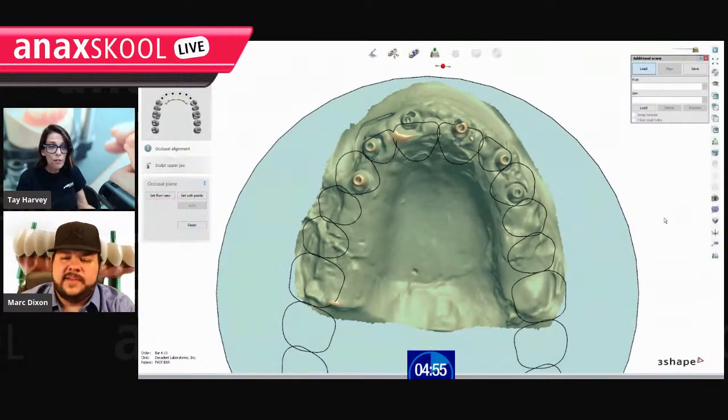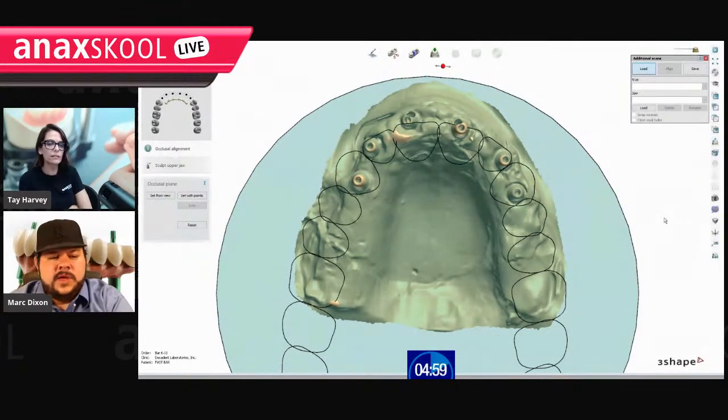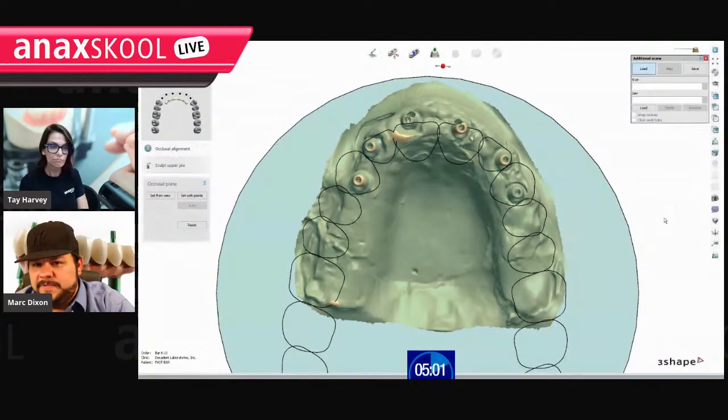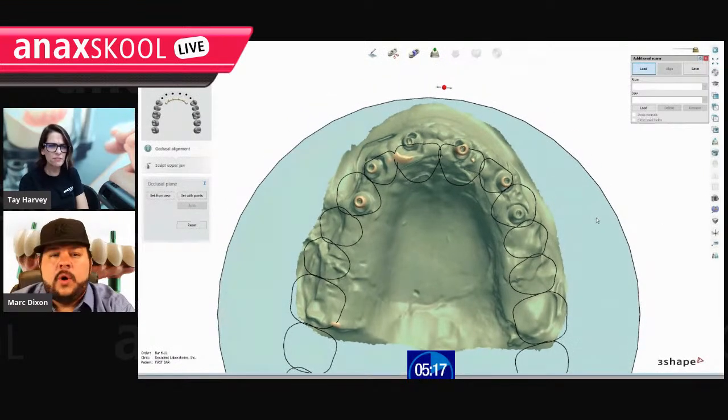That's nice. And so do all 3shape users have access to that? Absolutely not. You either create it yourself, you get it from a friend of a friend of a friend. You can marry into it. If your wife knows how to create thimble libraries, maybe you should marry that woman. Or you go online and you can purchase them. So this is OutCAD. I believe it was like $50. Oh, okay. It's the best one there is.